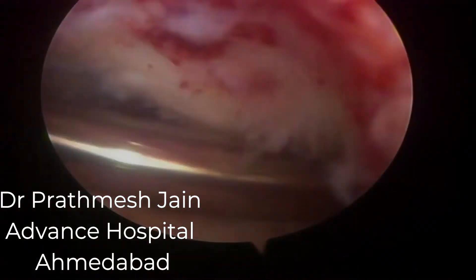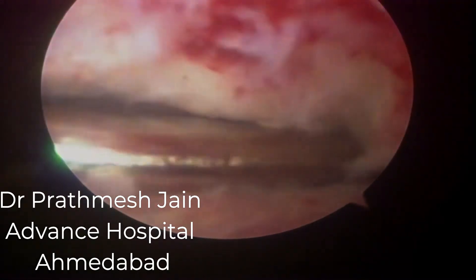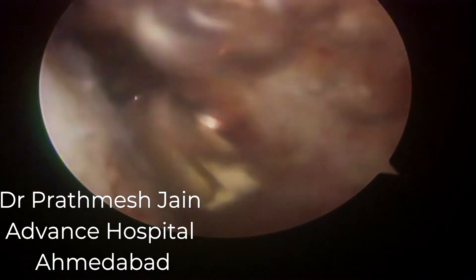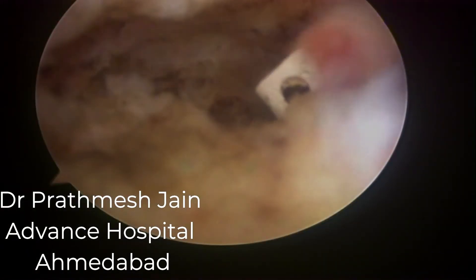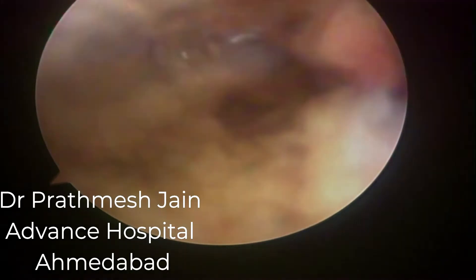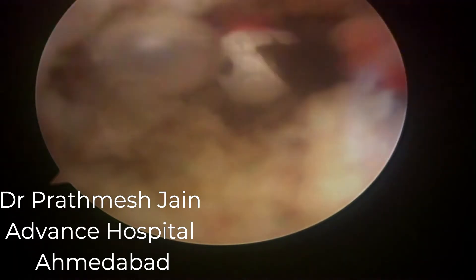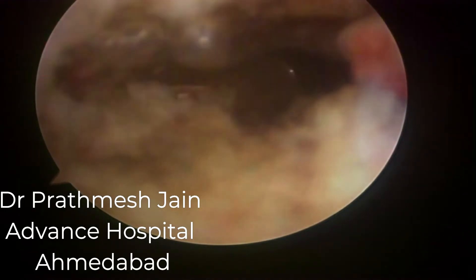You should be very cautious while releasing with the shaver. A few good tricks: do it under pressure — I usually use gravity pressure but you can use a pump as well. Most importantly, use radiofrequency ablation. Radiofrequency ablation has the advantage of releasing the bands while simultaneously controlling bleeding points. We release the thickened bands and then perform good coagulation with the electrocautery probe. This works very well in this scenario.